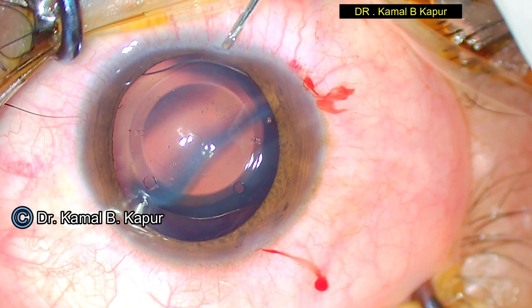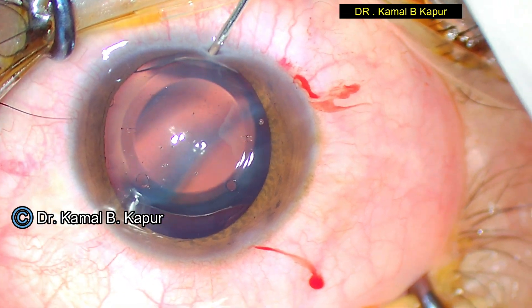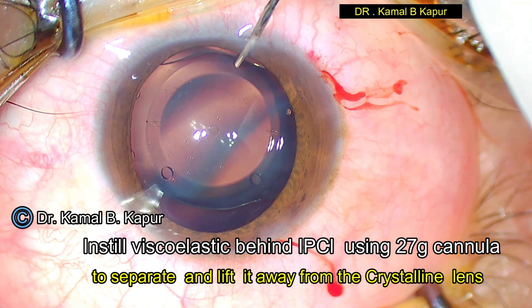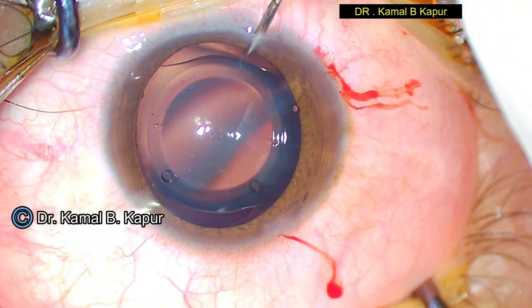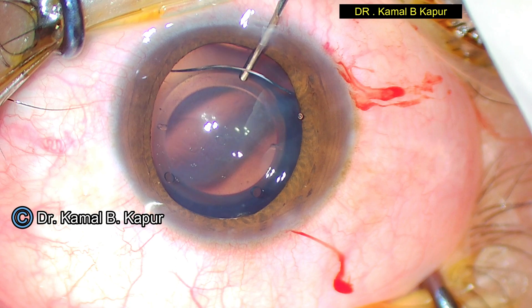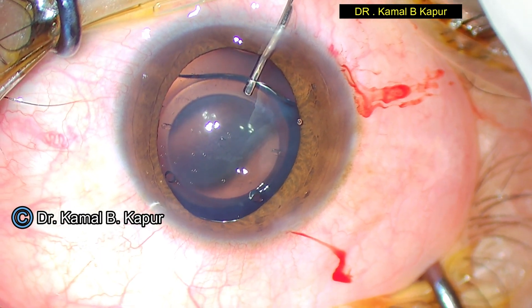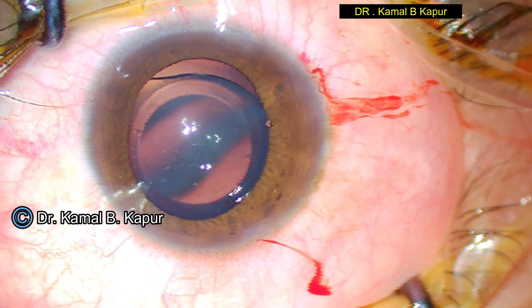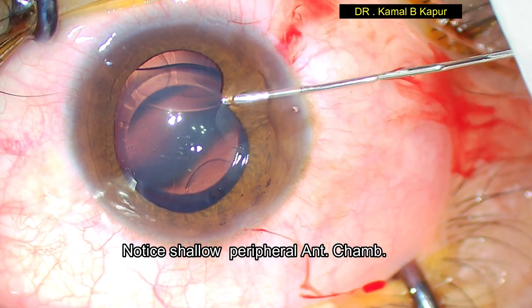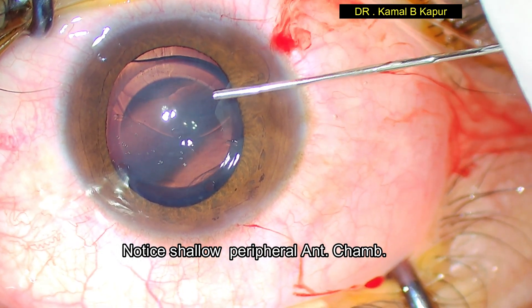We use a 27-gauge cannula to push in viscoelastic very carefully behind the phakic lens. This can be very tricky unlike an explantation of a normal phakic lens, because since the lens is reversed, it is actually touching flush to the anterior capsule. So we instill the viscoelastic behind the phakic lens to separate it from the capsule.